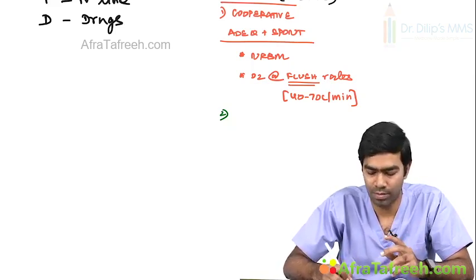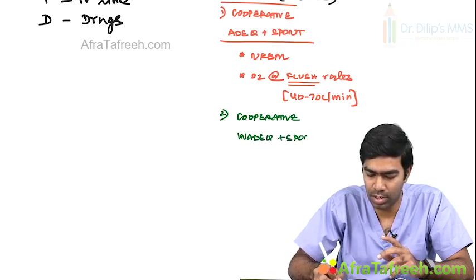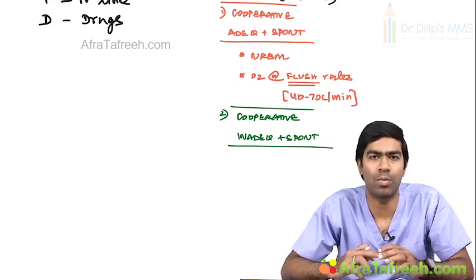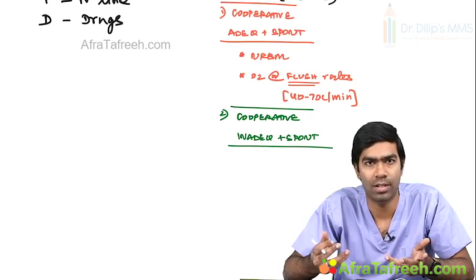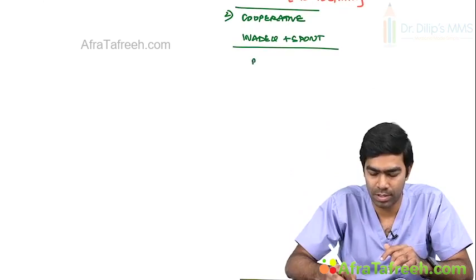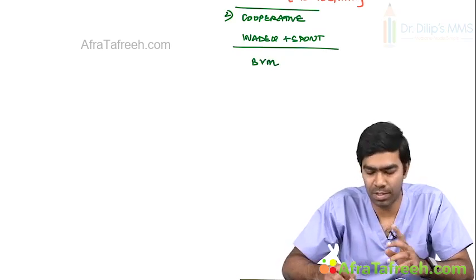Second condition, what if the patient is still cooperative, but is not having adequate, but inadequate spontaneous ventilation? Inadequate spontaneous ventilation, which means he's not taking sufficient breaths. He's having hypoventilation. He's taking shallow breaths. So you have to support those shallow breaths. Otherwise, you cannot pre-oxygenate adequately again. So to support those shallow breaths to full breaths, you need to bag the patient. So we will be doing bag valve mask ventilation with or without PEEP, but BVM is mandatory here.